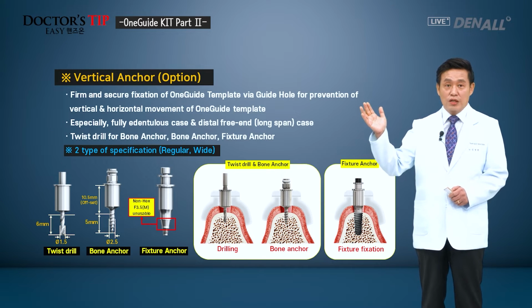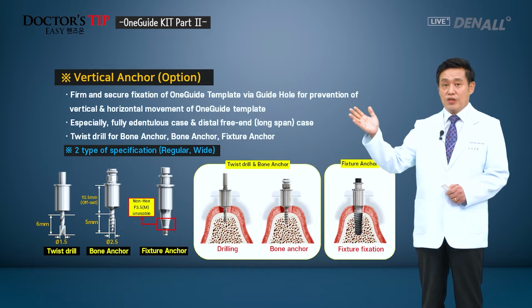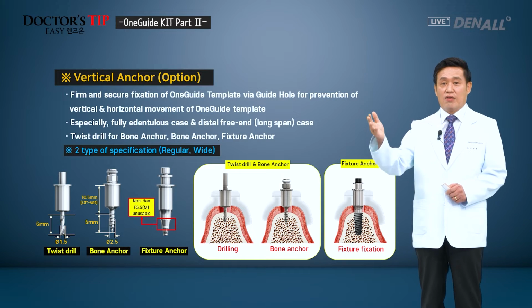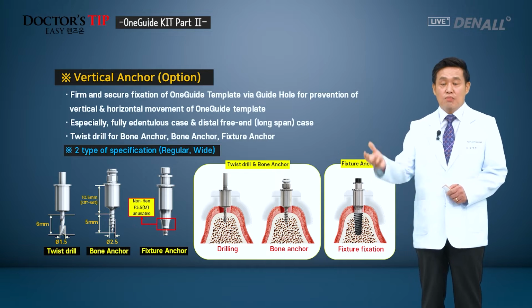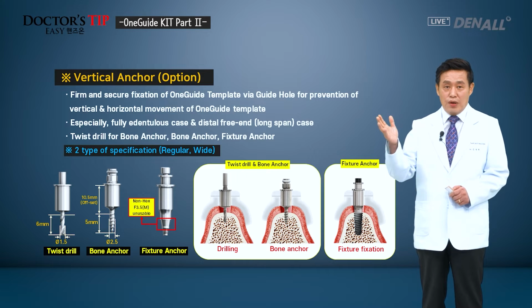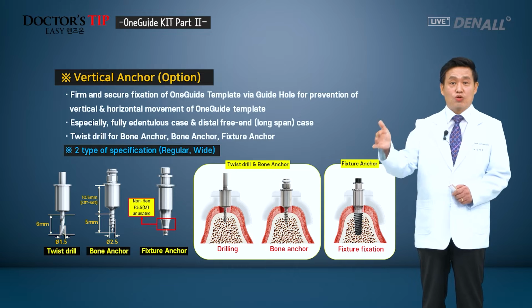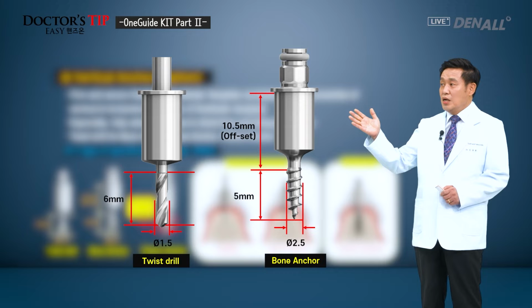Another option is vertical anchor system. Lateral anchor system mentioned earlier. At times, depending on palatal or gingival thickness, template deviation can occur. So, virtually planned fixture position can be deviated. And in order to prevent this, vertical twisted drill and bone anchor is used.